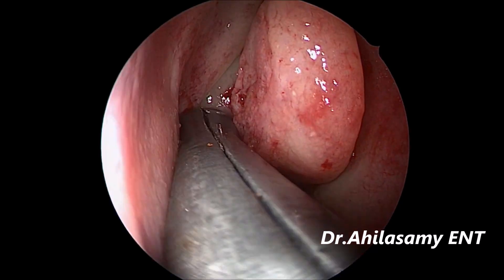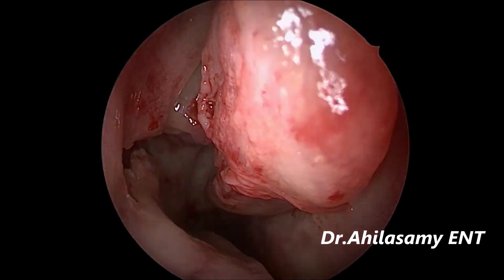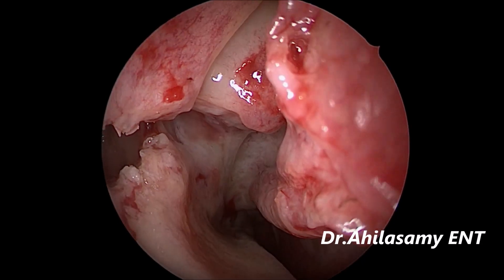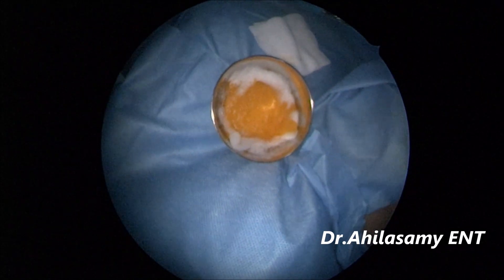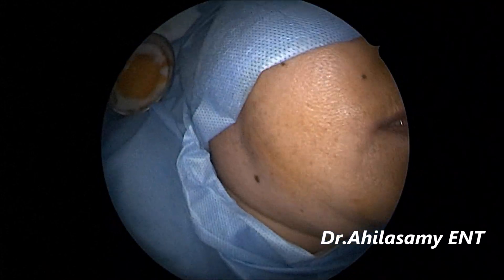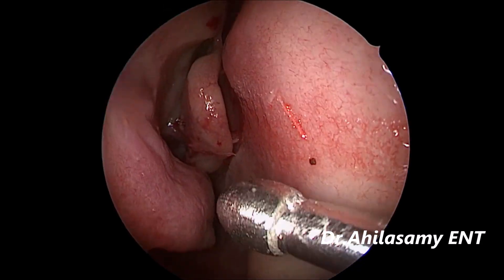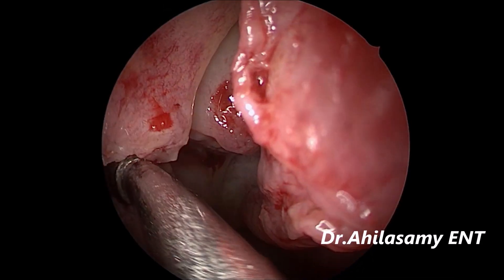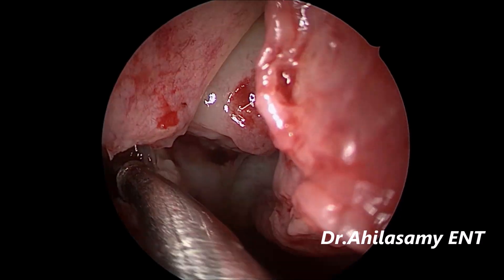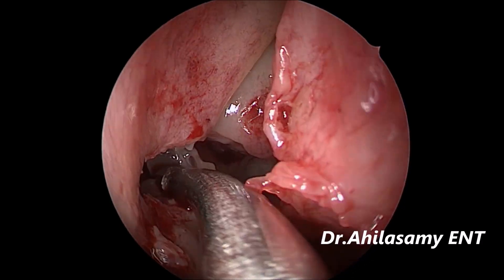Again two and three. You can have a look — you have entered into the antrum. Now you widen the MMA. Never miss the natural ostium. When you do these three bites, you will include the natural ostium. The secretions — see — are coming into the suction. Thick secretions; under local anesthesia you see hardly any bleeding — it will be like a cadaveric field.